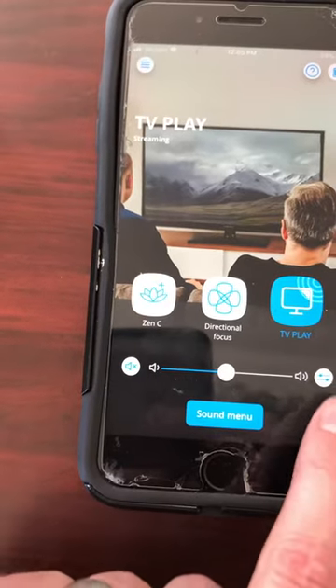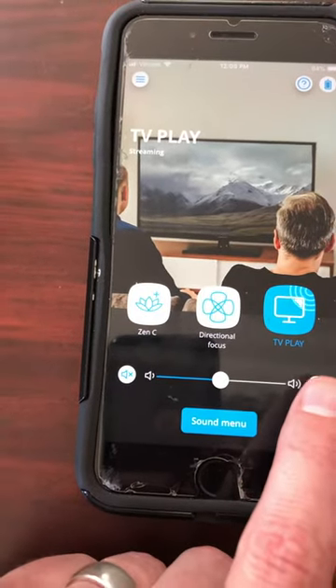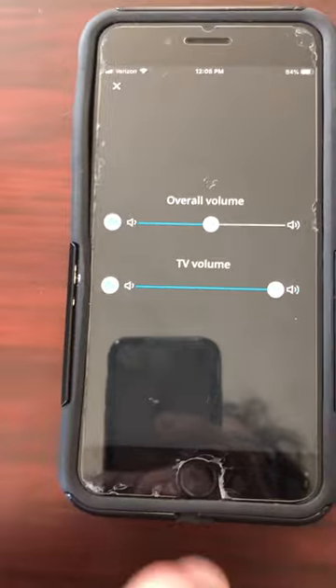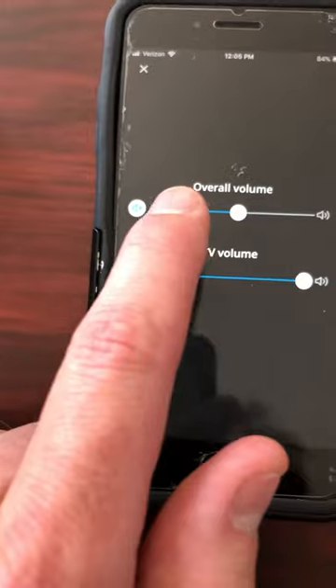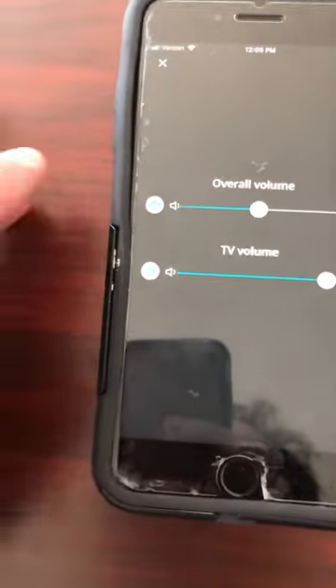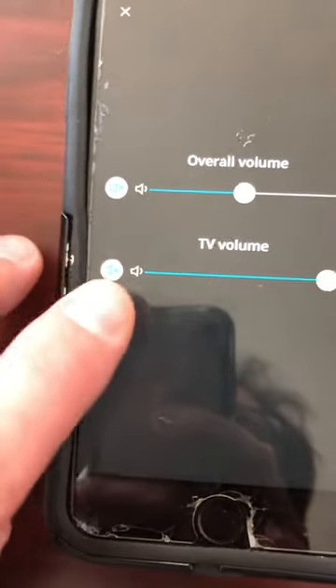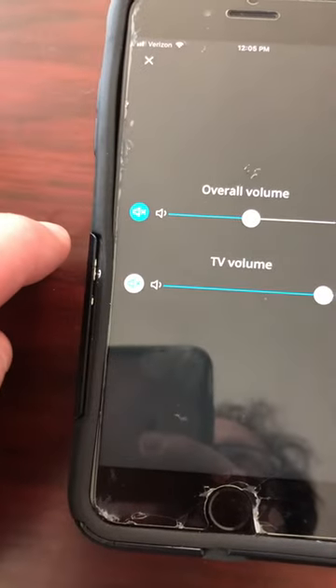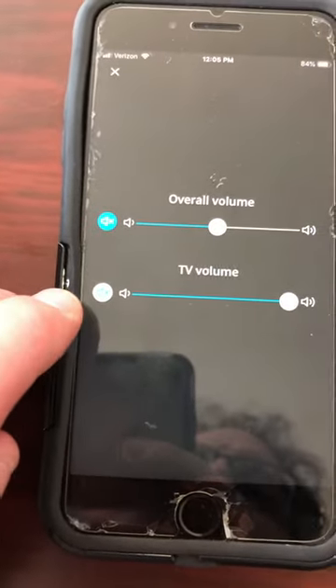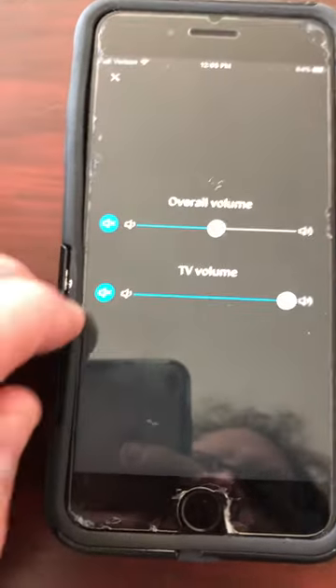You can access different parameters through this button right here. This will allow you to turn up or down the volume of the television, and up and down the volume of the microphones. There's also a button to the left — it is a mute button. You can turn off the microphones of the hearing devices by tapping that, and you can mute the audio signal you're getting by pressing that button as well.